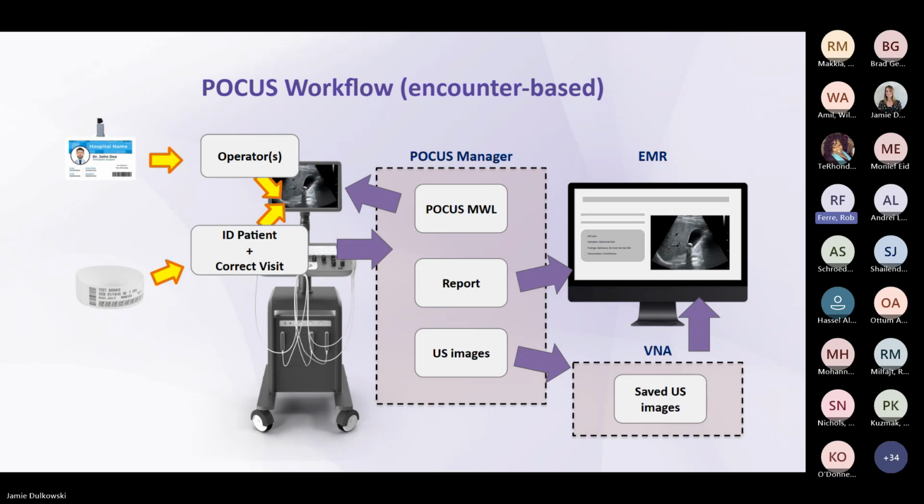The gist of this is that when a patient is registered, that populates the modality work list. We also have identified operators, known operators through Active Directory or through some employee directory that the hospital has.